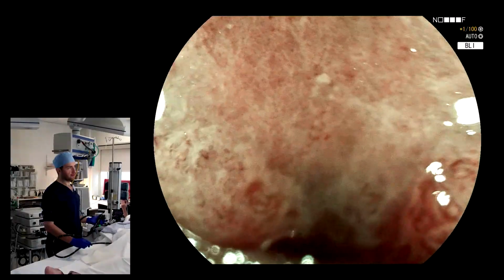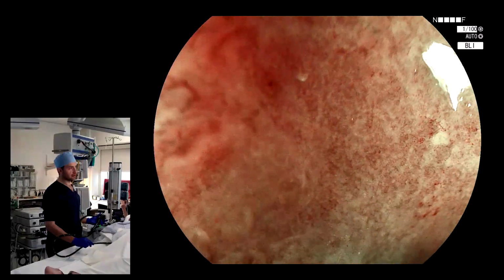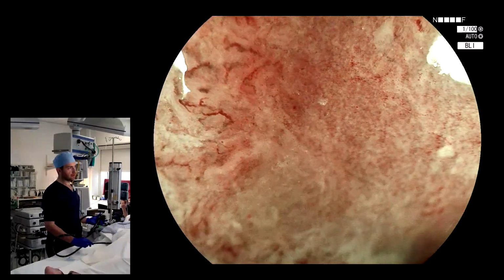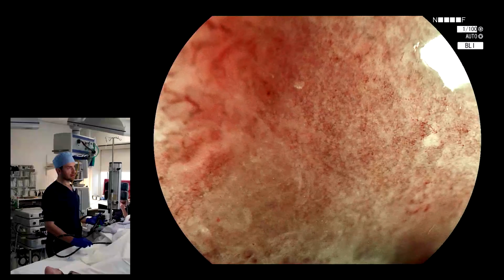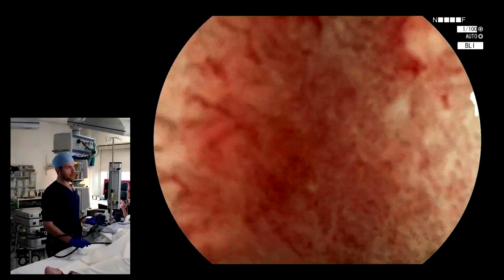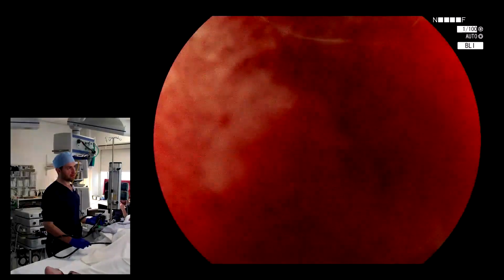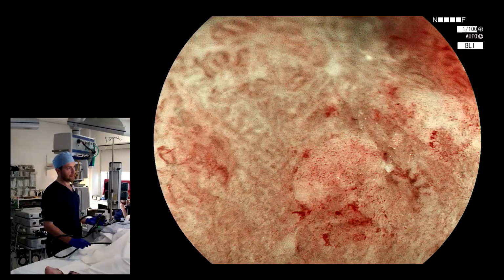And when we go in further, even more, to maximize the zoom functionality of this endoscope, we cannot easily keep the focal length, or I can't in this situation. And this is actually relatively stable, but you may want to become more stable. And so, for example, we may want to interrogate this area here, which may be a previous biopsy site of this lesion. And so we can get a nice freeze frame, but maybe we can do better.